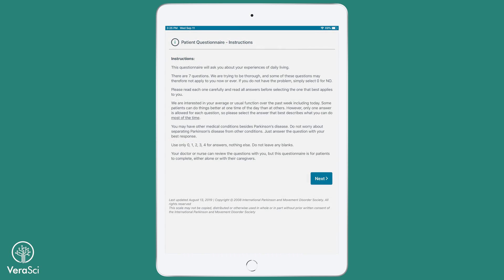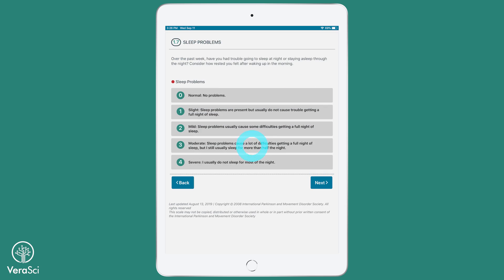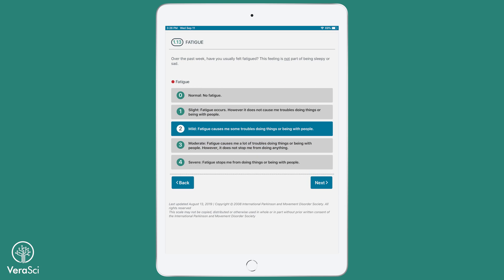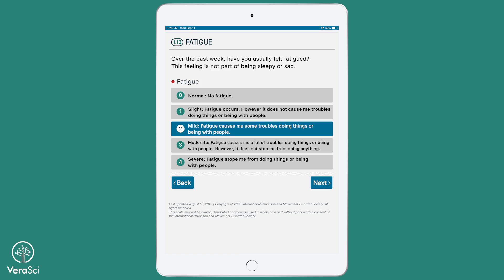Part 1B and Part 2 both contain items that are completed directly by the patient or caregiver. These PRO sections are easy to navigate, and the font size can be increased for studies with populations that have visual impairment issues.